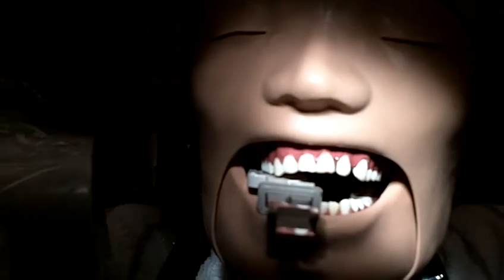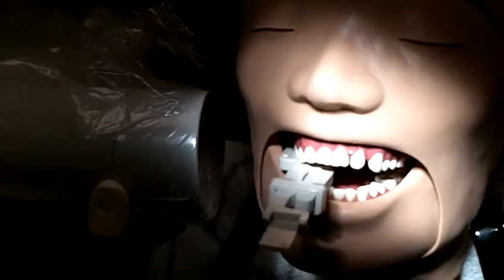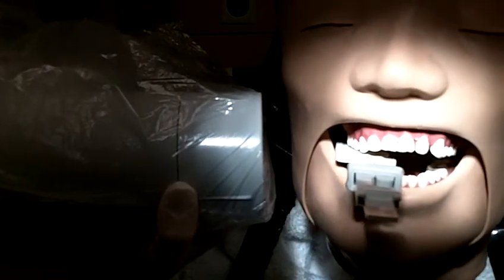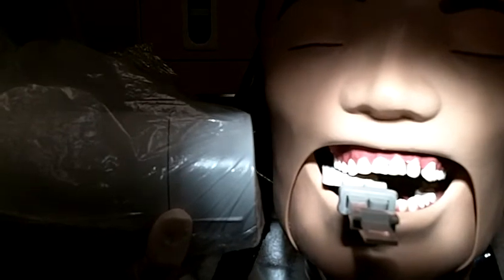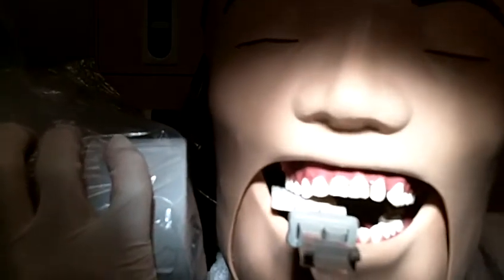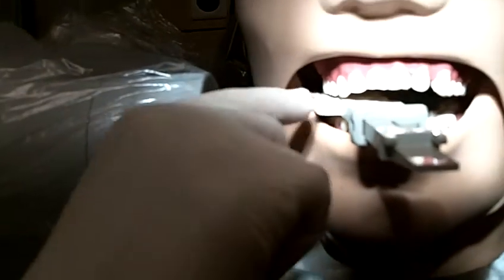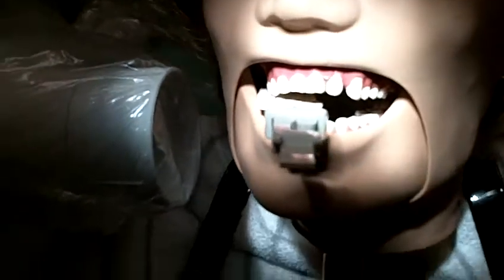Okay, so we look for the edge of the film and I look like I'm lined up right there. Line it here, got my scope going a little lower, Kirsten — like that? Yeah, because what we're looking for is — remember the film is down here, right? The top of the film is right there, so you want to go down. There you go. That makes sense because the film is right there. Okay, hold on, let me get out of the room.